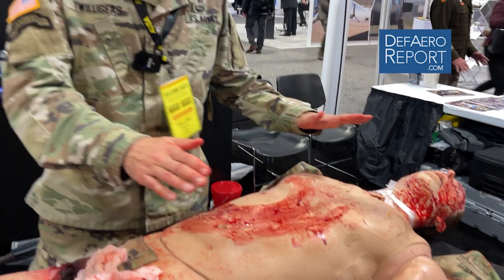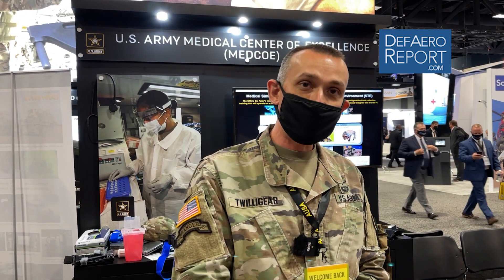Essentially what this does — although we do the medical thing and we talk about lifesaving — integrating this training is what allows our squads, platoons, and companies to maintain defensive capability after they have casualties.